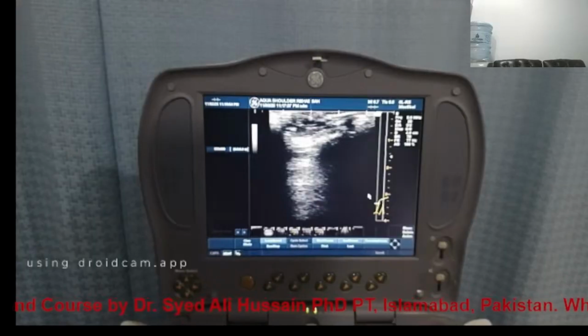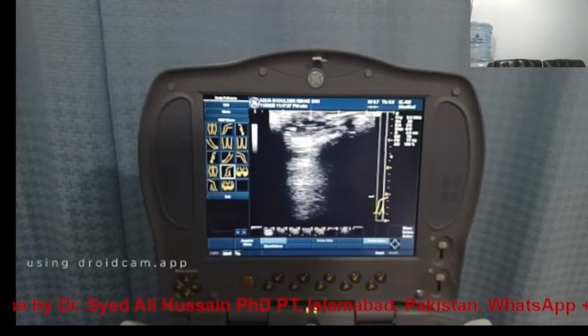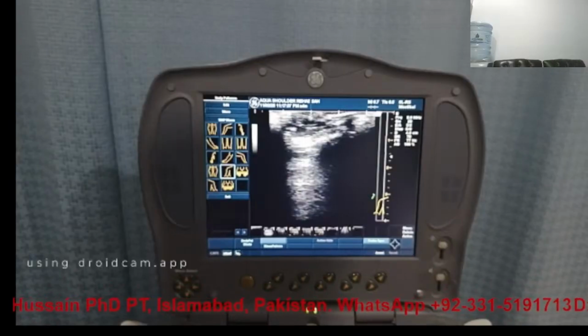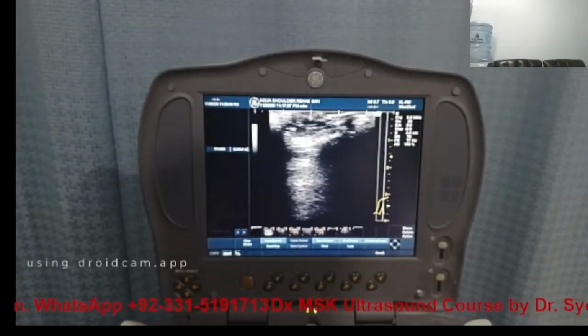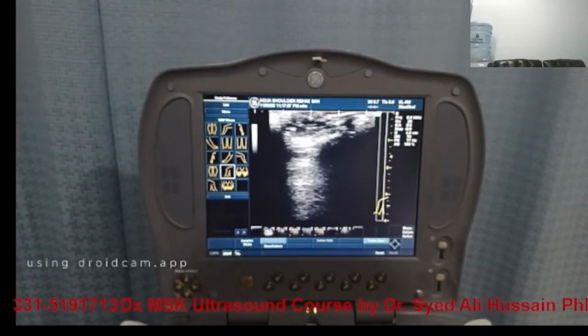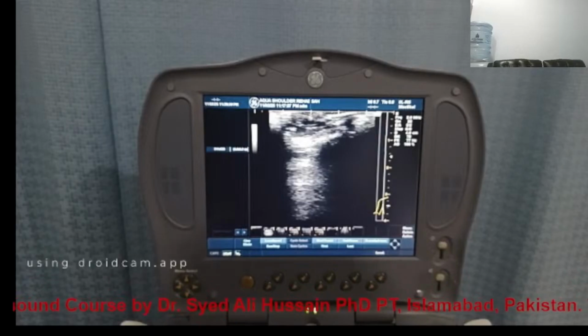We can place this anywhere we want, and we can change the orientation of this arrow as well. So if we want to move the pattern, we can easily move it. Not needed right now, so we can click clear and go on to the comment.